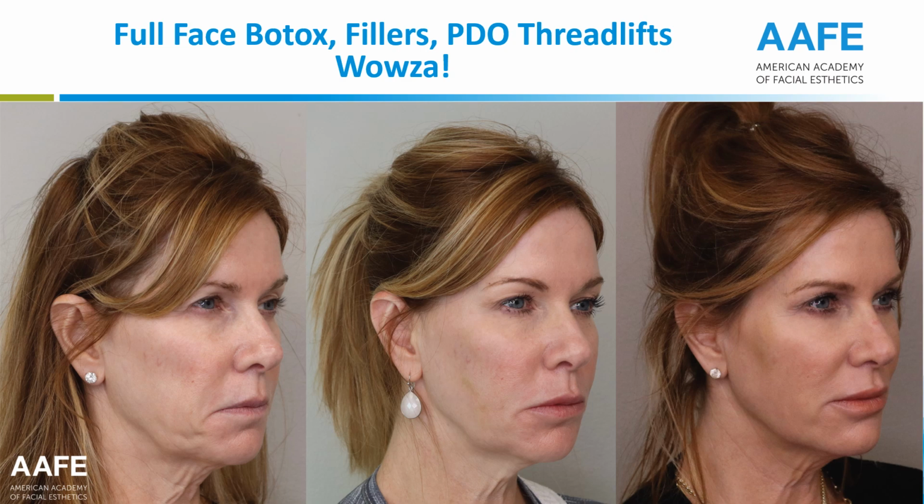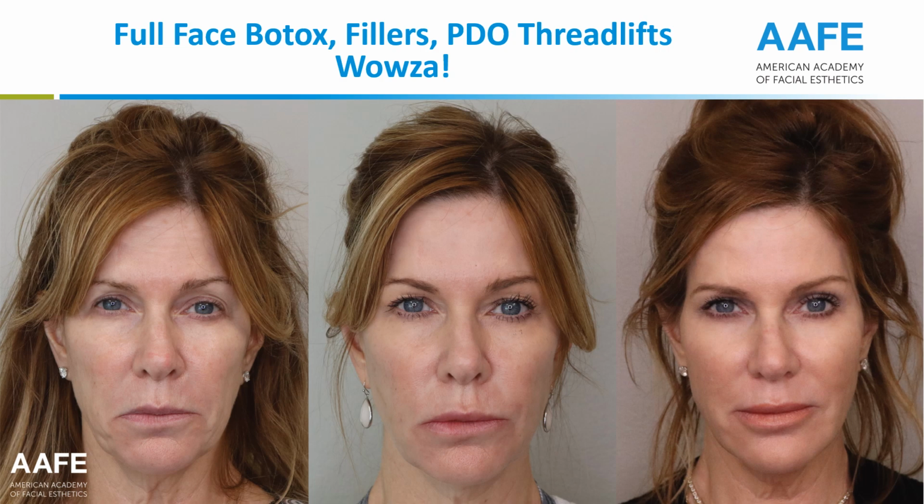I mean, again, this is a transformation over time, but you can see amazing transformation on this patient here, certainly from the front there as well. Could you do this with a facelift? You could. Hang on. You can't do this with a facelift because a facelift does not add volume. So it's different. And by the way, we do a ton of PDO threads on patients after facelifts. But lifting PDO threads can last anywhere from 1 to 2 years. Many patients, they last longer than that.